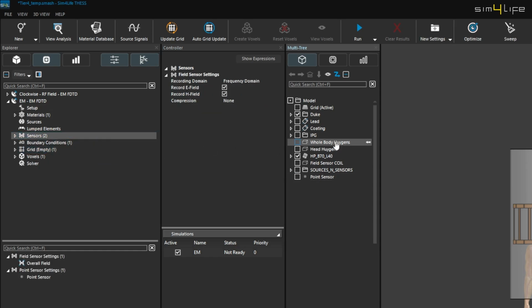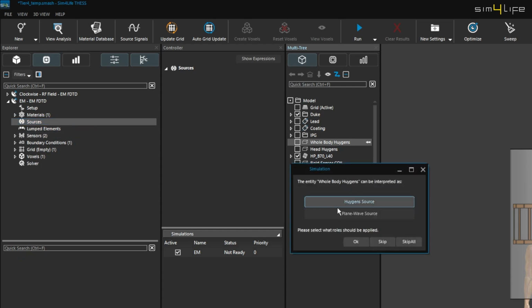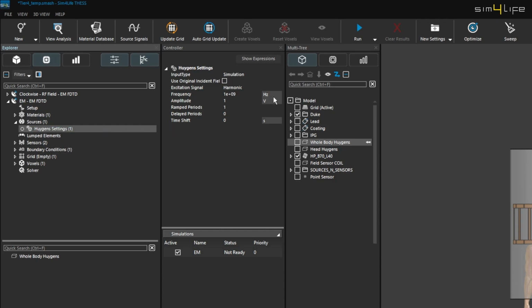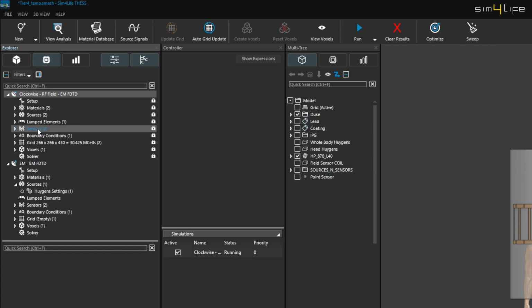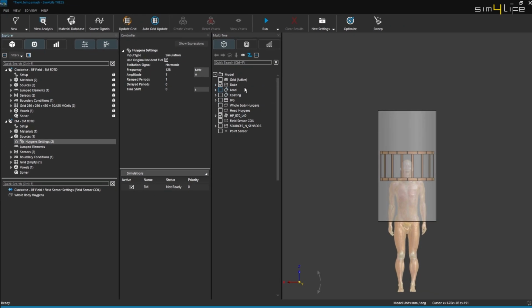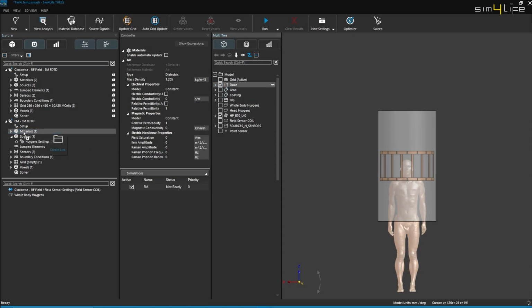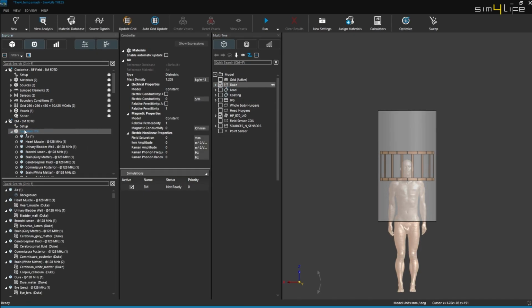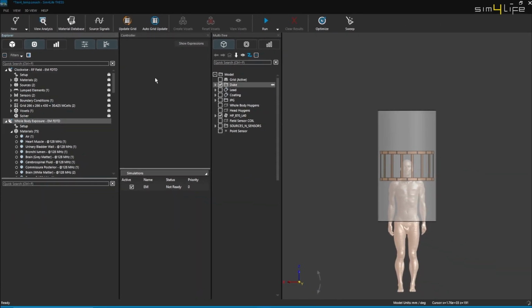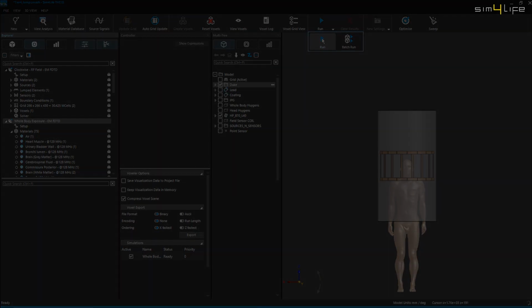We set up the whole body Huygens source, specify the frequency at 128 MHz, and make sure that we check use original field amplitudes. We finally link the field coil sensor from the previous simulation by dragging it into the Huygens settings. Next, we add the Duke model to the materials section, automatically assigning dielectric properties from the IT'IS material database. Duke will be automatically discretized at a 2 mm resolution. We rename the simulation to whole body exposure, update grid, create voxels, and run it.